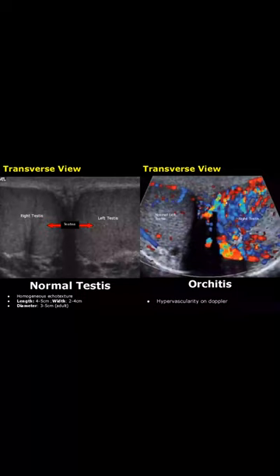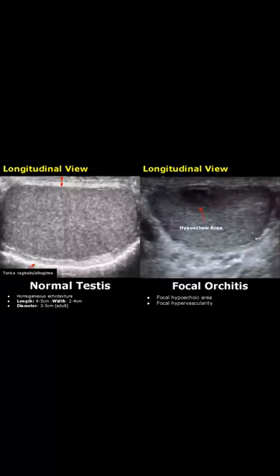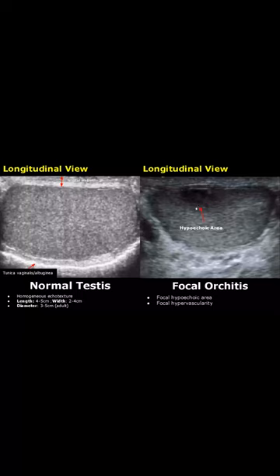In the inflamed testis, you can see a large amount of blood flow in the affected testis. Focal orchitis can also occur, and we'll see a focal hypoechoic and hypervascular area.